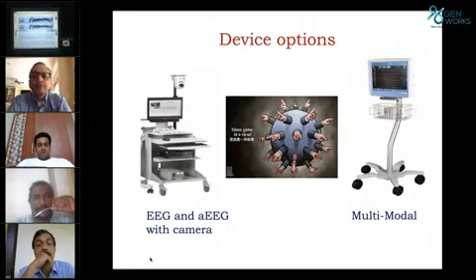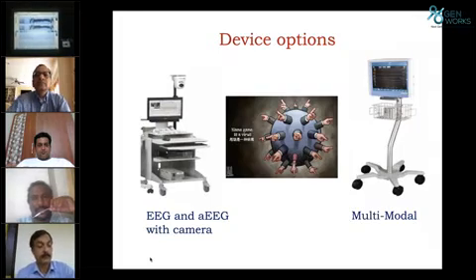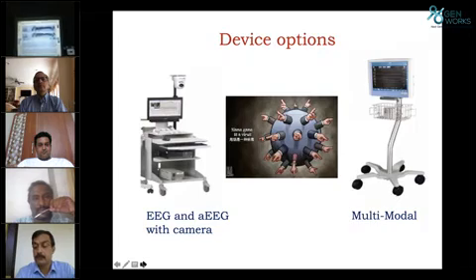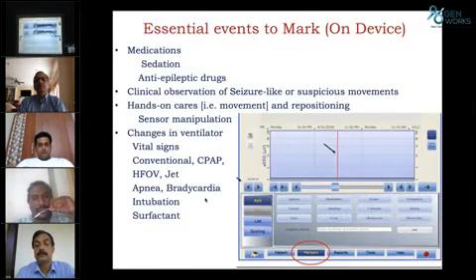Once they are putting the markers, at least when we are reviewing the tracings, we can know that this change in the tracing is because of some external activity, some medication that is given to the baby, like some sedatives or anticonvulsant, so that can be noted under the marker. In the right circle you can see the marker, so they just have to add the markers.